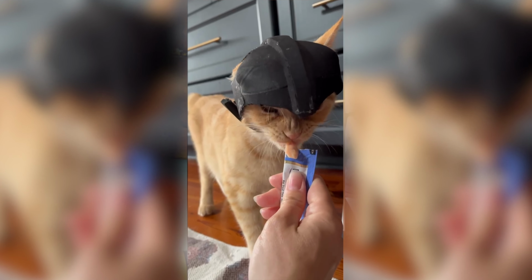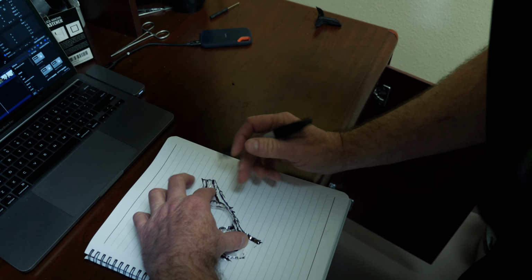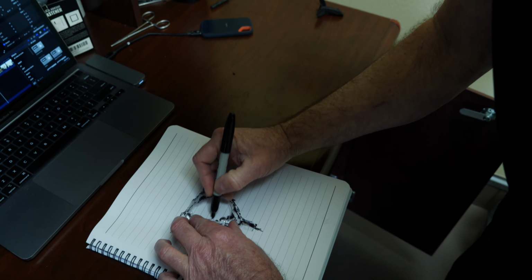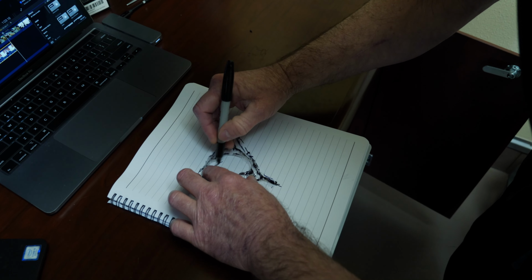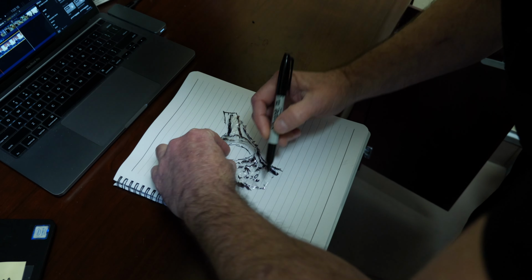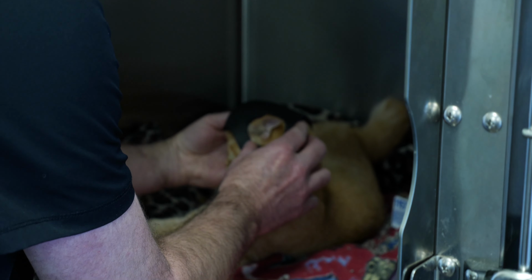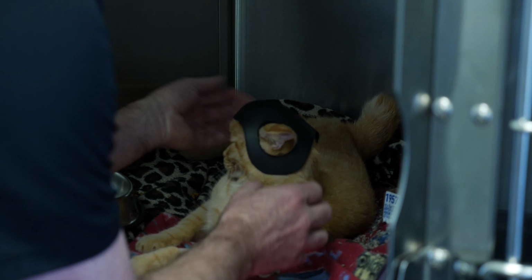This would cause him to walk a little funny, like he was trying to walk underneath something. When Dr. Yates did Leo's CT scan, he needed to be anesthetized. So I took that opportunity to wrap his head in some cellophane, and then I took a Sharpie and made a pattern of where I thought the helmet should be on his head. That gave me all the measurements I needed to make a nice form-fitting helmet out of foam and thermoplastic.